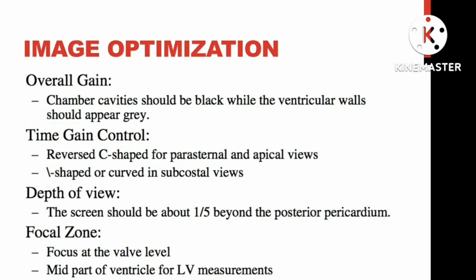Depth: adjust the depth until you see the posterior pericardium. Okay, you need to see the whole pericardium. Focal zone is the focus. Where do you focus? There is a cursor in the ultrasound, so that's the focus. What is your focus area? So you can do this to optimize the image and have a better image.